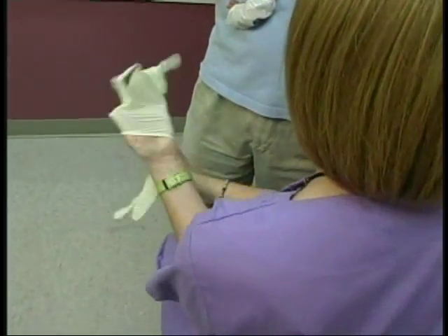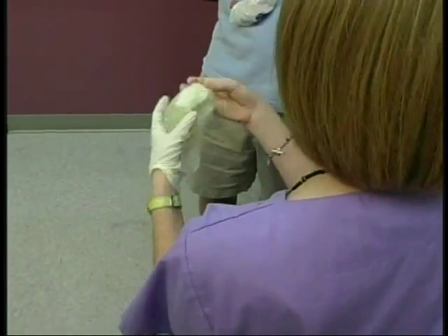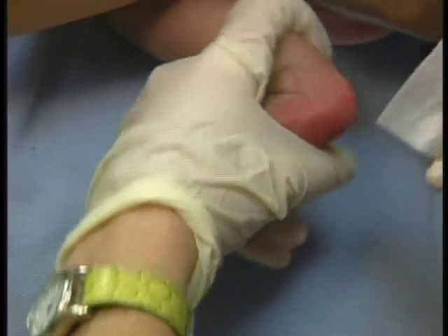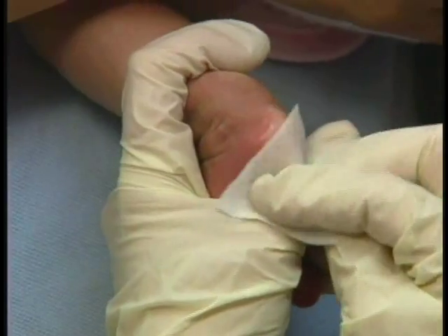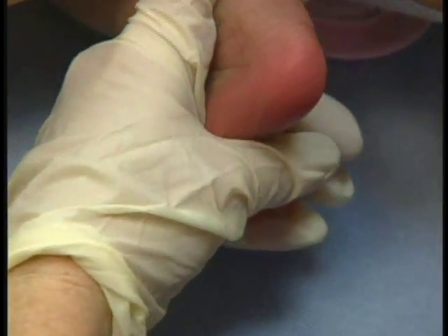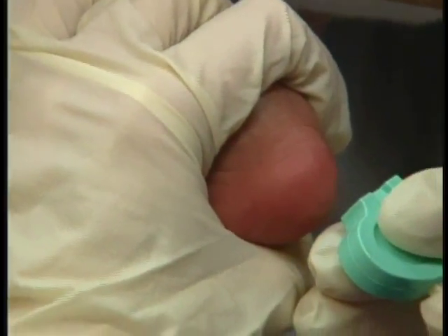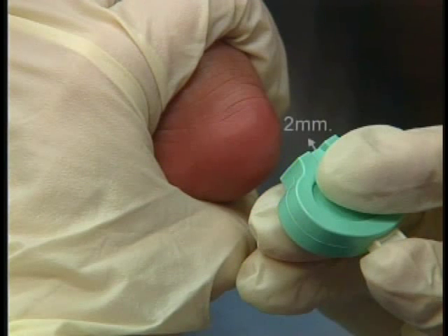Please remember to use sterile gloves while handling the baby for the prep and stick. The next step is to cleanse the site with sterile alcohol prep and wipe dry with a sterile gauze pad. Be sure to let the site dry thoroughly. For the heel stick, you will need a sterile lancet with a tip that is approximately two millimeters.